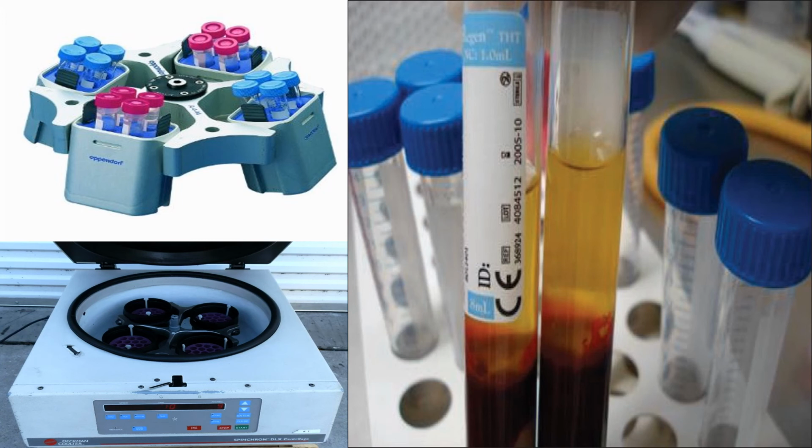So again, the recommended type of centrifuge for obtaining our platelet-poor plasma is the swinging bucket centrifuge. To distinguish this from the angle head: in the swinging bucket, before the rotor starts to spin, the samples are in a vertical position. When the rotor starts spinning, the position of the samples changes from vertical to horizontal. After 15 or 20 minutes, this is your PPP. Again, you have to remove this using a Pasteur pipette and transfer the sample into a plastic tube or a silicone-coated tube.